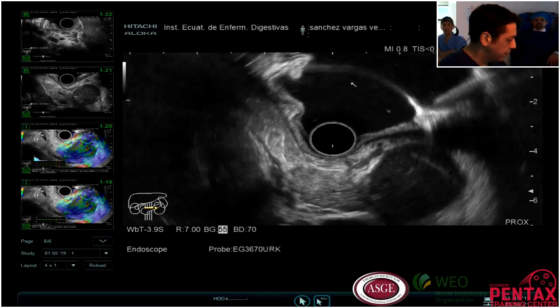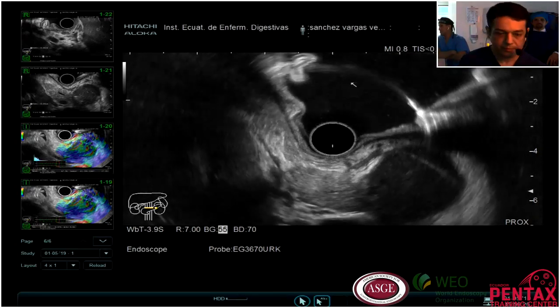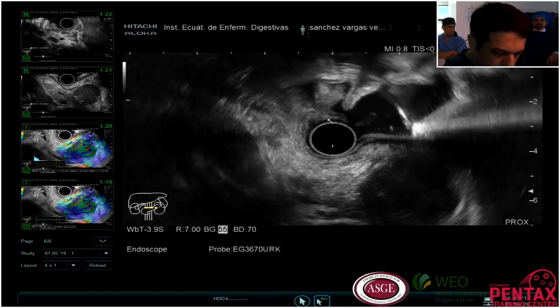¿Tenemos el contraste listo o no? ¿Dónde está el aplicacionista Itachi? Momento.